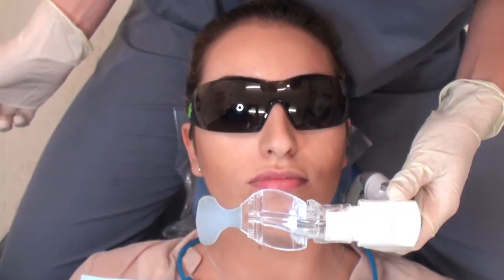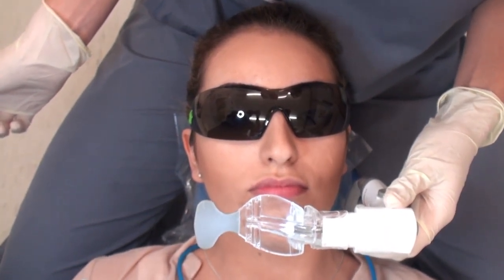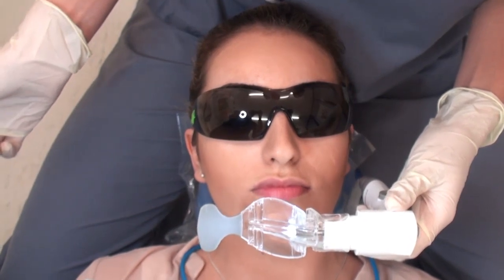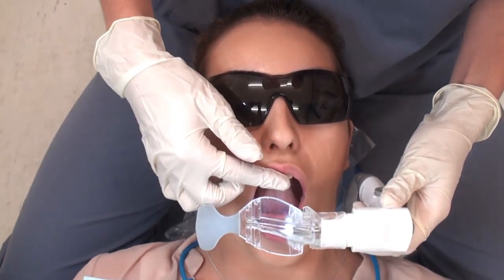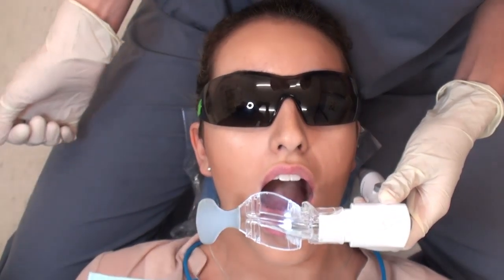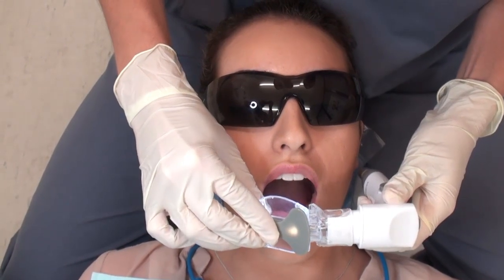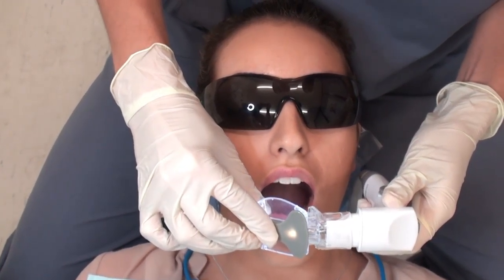Start by holding the mouthpiece in the correct orientation in front of the mouth, with the bite block part of the mouthpiece aligned in front of the teeth that are opposite to the teeth you are working on. Bend the end of the mouthpiece towards the tongue depressor — the soft flexible material of the mouthpiece will bend easily.